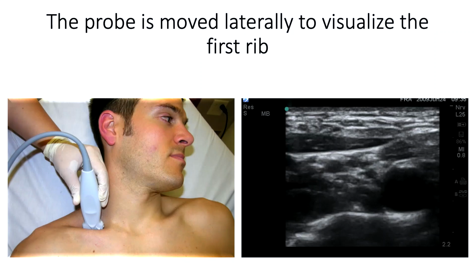you will have a stable probe, and you won't have to be looking down whether you are parallel to the clavicle or not. And here you see the subclavian artery, then you see the compartment made by the subclavian artery, the first rib, the shadow of the insertion of the middle scalene, and you see the prevertebral fascia, and sliding over, you see the omohyoid. So now, this compartment contains everything you need to block.